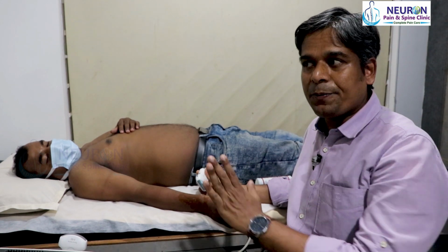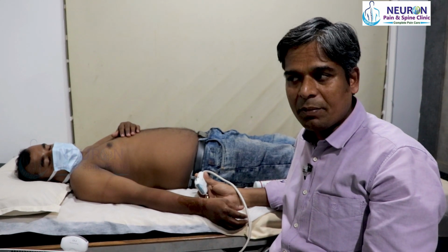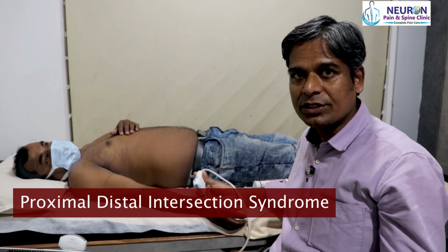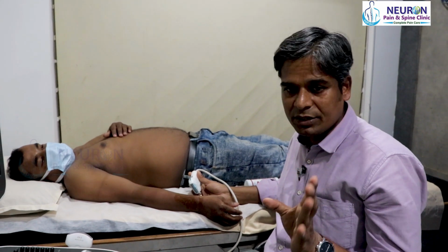So after knowing how to scan and identify the six different extensor compartments, now I am going to talk about the proximal and distal intersection syndrome. Proximal intersection is, by the way, more common than distal intersection syndrome.